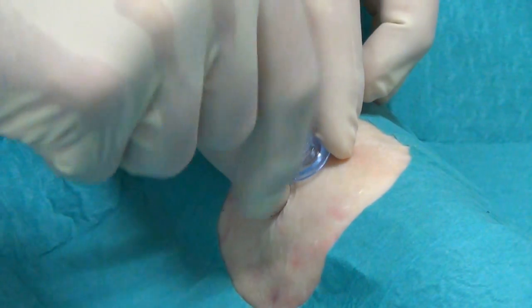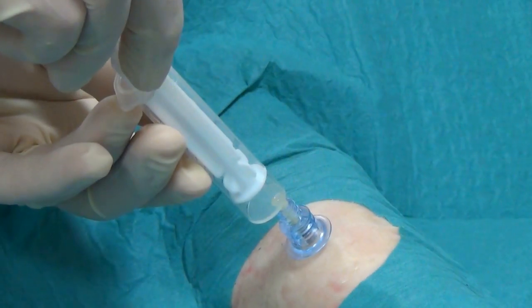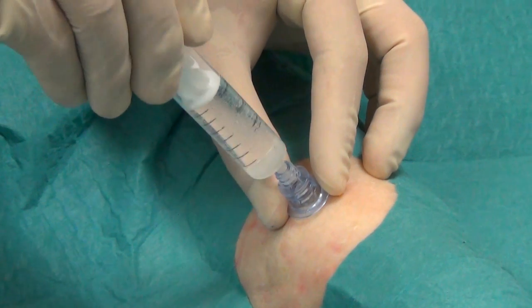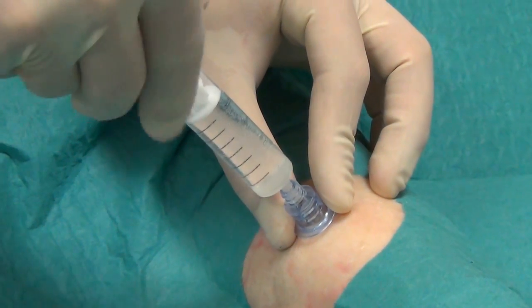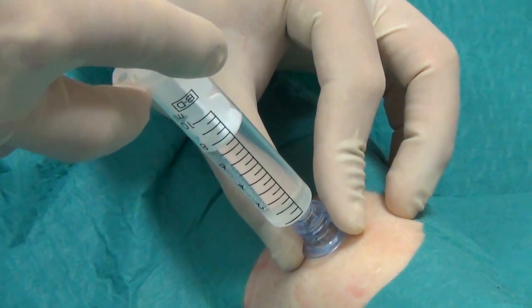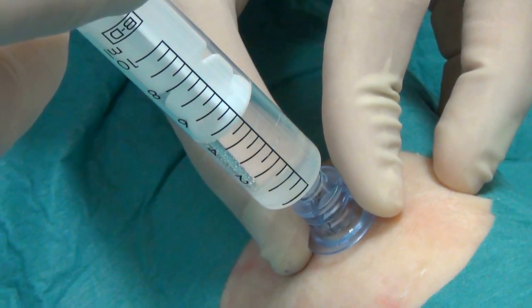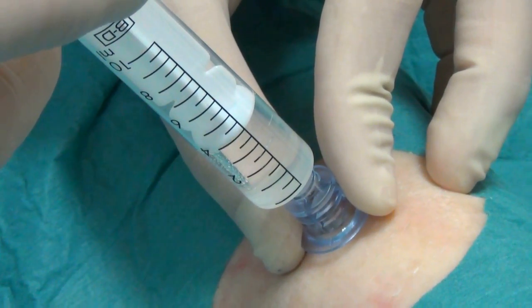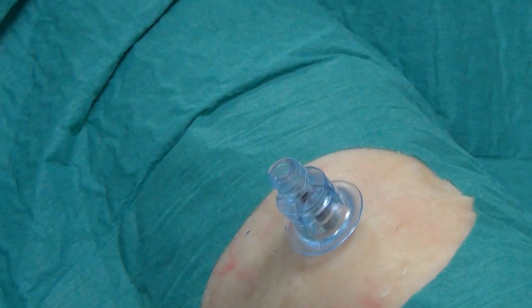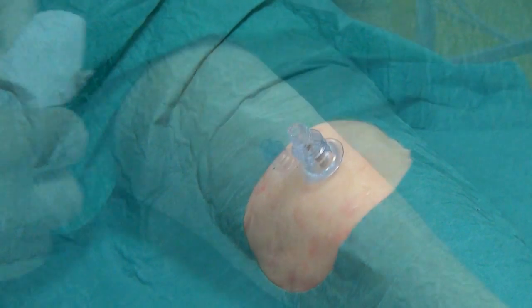Remove the stylet and confirm the good position of the needle into the bone cavity with bone marrow or blood aspiration. Administer saline without subcutaneous tissue swelling and without resistance before putting a dressing to avoid dislodgement of the needle during resuscitation or transportation.